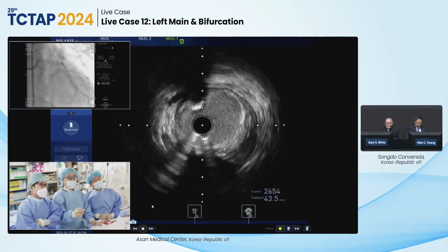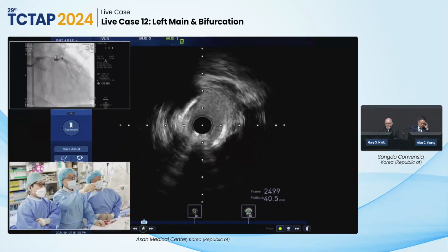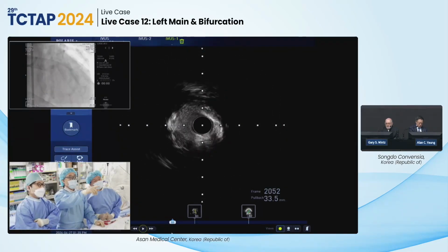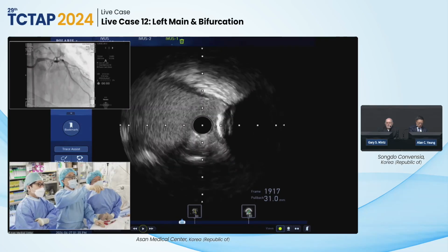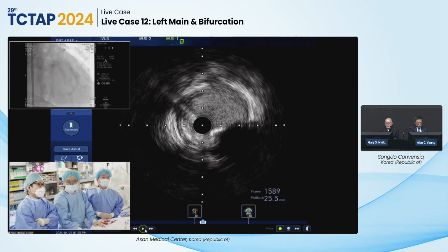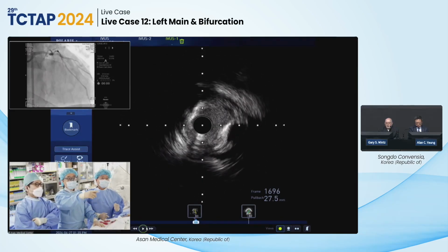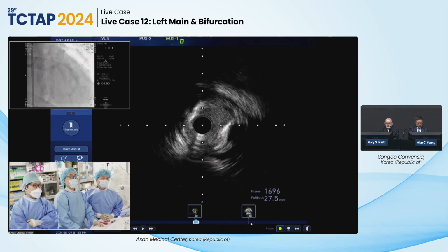So we're going to show again the bifurcation, where the distal part narrows. Before you do that, could you start the run and show people what a muscle bridge looks like, myocardial bridging? Start at the beginning of the run.